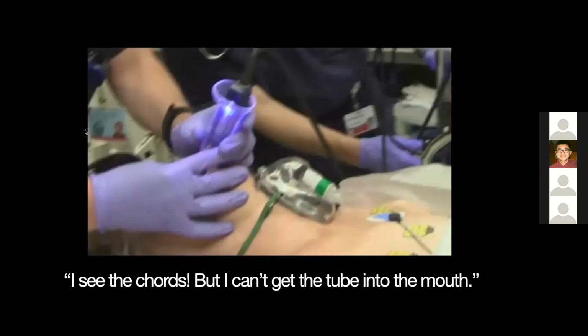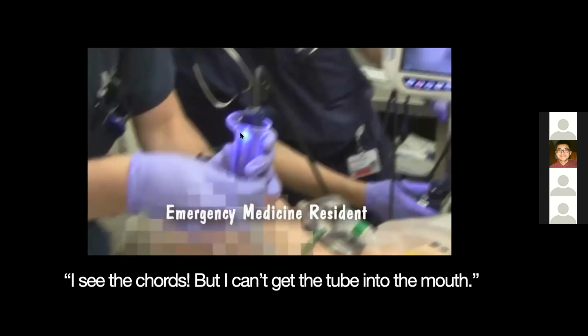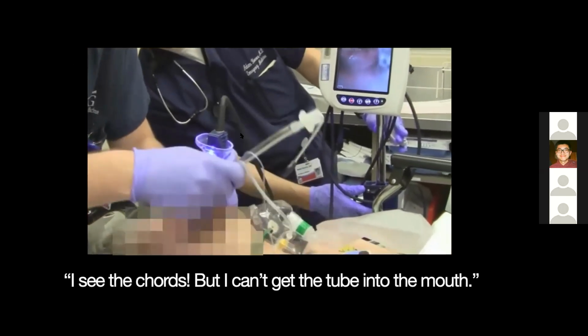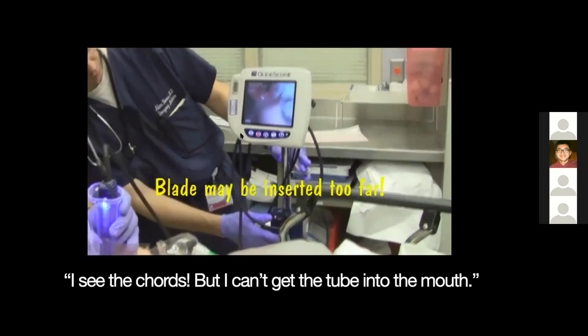So pitfall number 1. We're going to have a look at the video. You see the cords, just like in the video. You see the cords very well, actually, but you cannot get the tube into the mouth. And look how he is struggling, or he or she, but I think it's a he, struggling to just try to insert that tube in the mouth. He actually needs some help from another person.